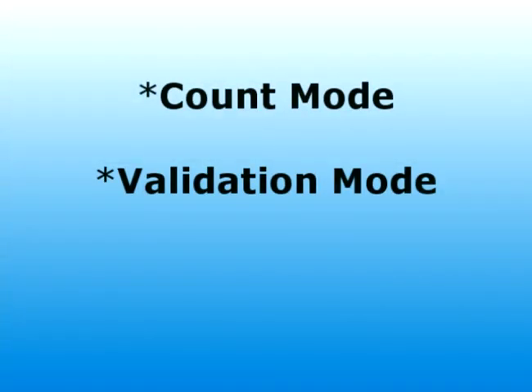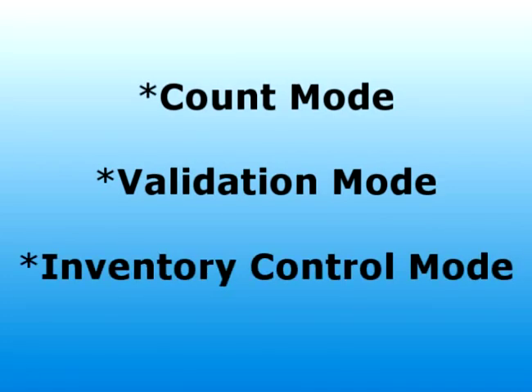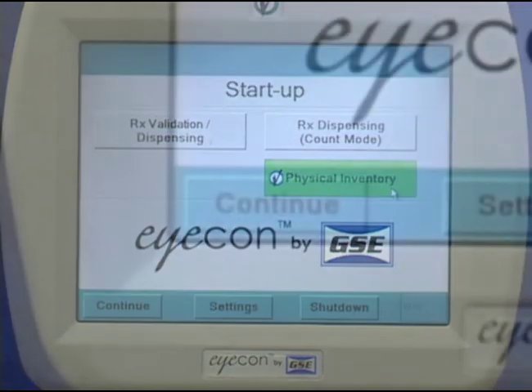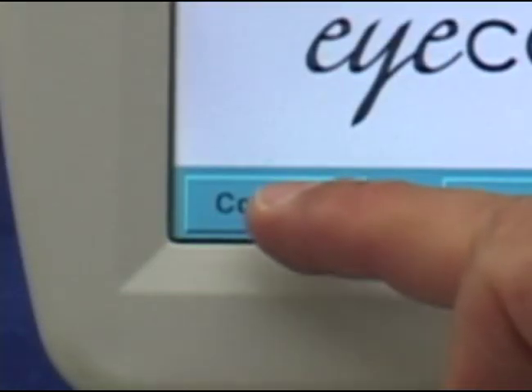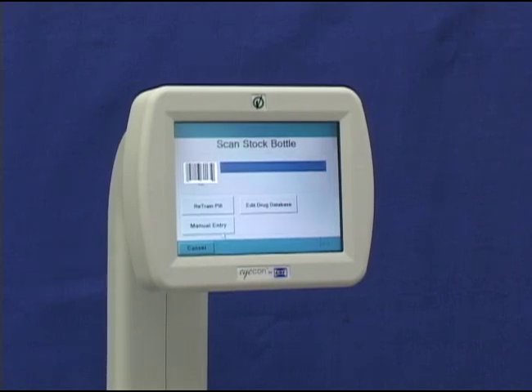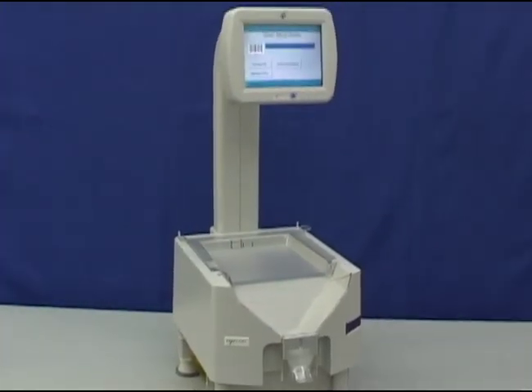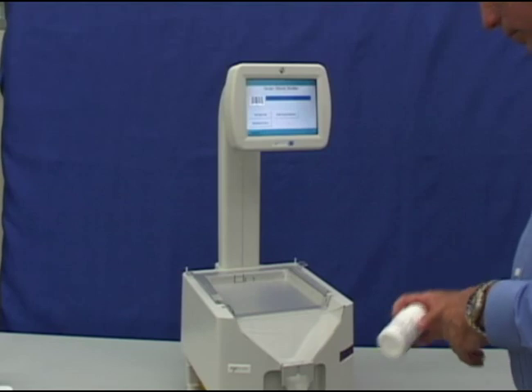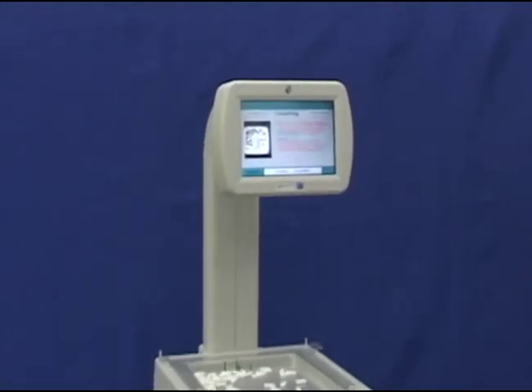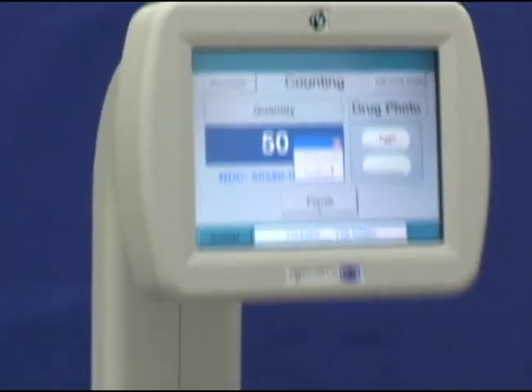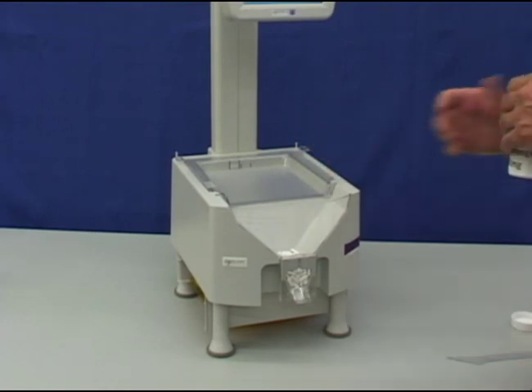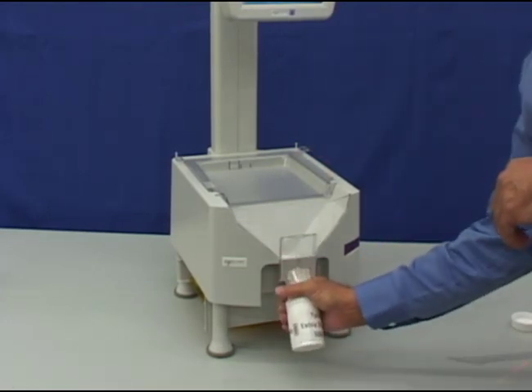The final mode is inventory control mode. From the startup screen, press the physical inventory button, and then the continue button to enter the inventory mode. To inventory a partially full stock bottle, scan the stock bottle barcode and empty the entire contents of the bottle onto the counting platter. Press the Finish button. Empty the platter into the funnel and return the pills to the stock bottle.